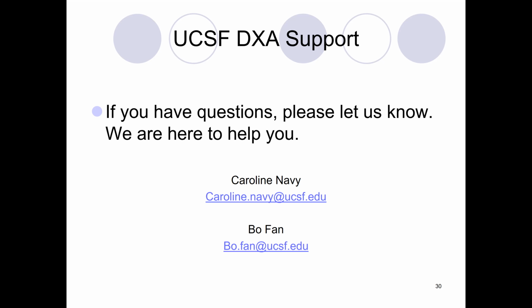Okay, sorry, I'm writing that down. My second question is, when we send the quality control data monthly or upload it to RAE, what exactly would you like us to upload? Is it the scan files, or would you like us to export the data set? The scan files. Because we're going to upload those scans into our database. So we need those actual scan files, not the reports or the export. Okay, great. Thank you. And we will be doing central analysis too for the phantom scan. So we definitely need the scan files. Got it. Okay.